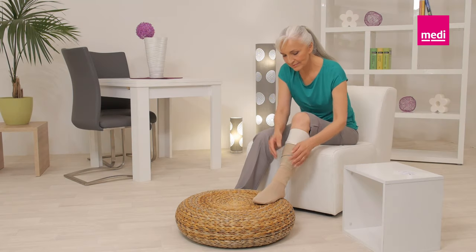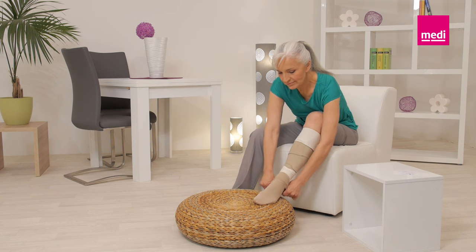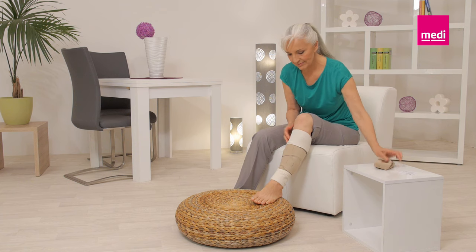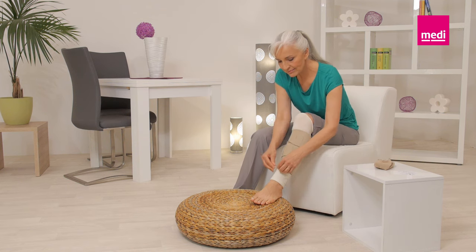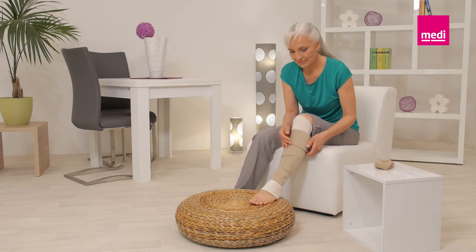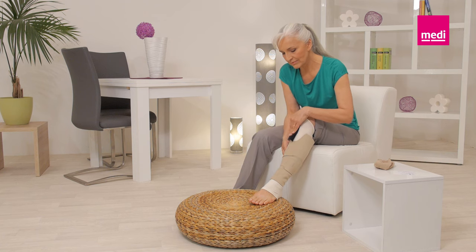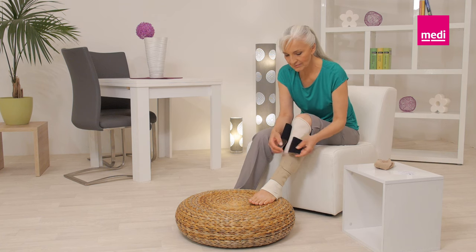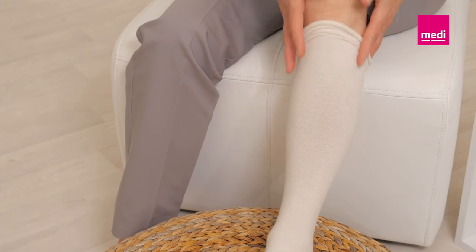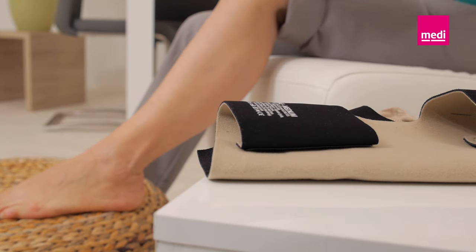To remove the circade juxtalite lower leg, remove the circade compression anklet first. Then unfold the circade undersleeve. Detach all bands of the legging, starting with the top band. Fold each band onto itself to keep the Velcro tabs lint-free. Remove the garment and then remove the circade undersleeve.